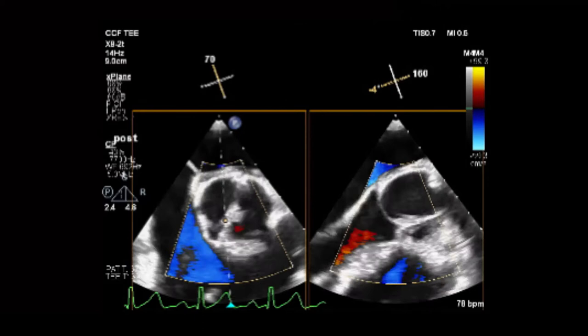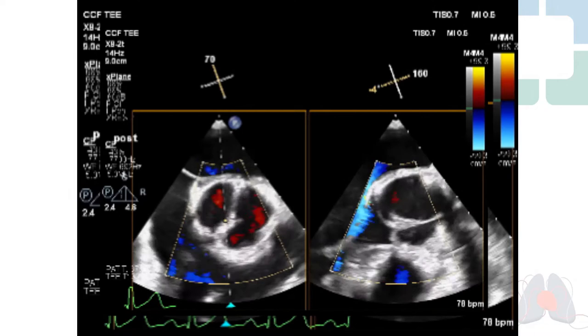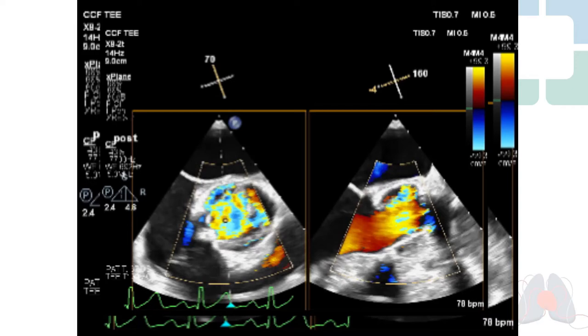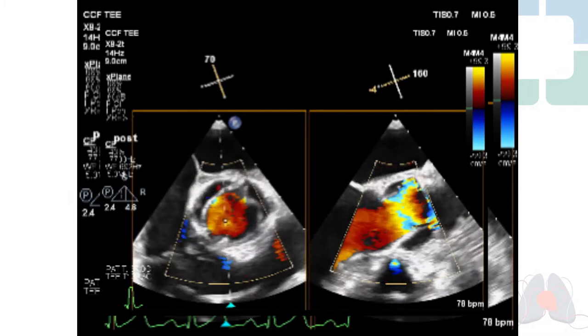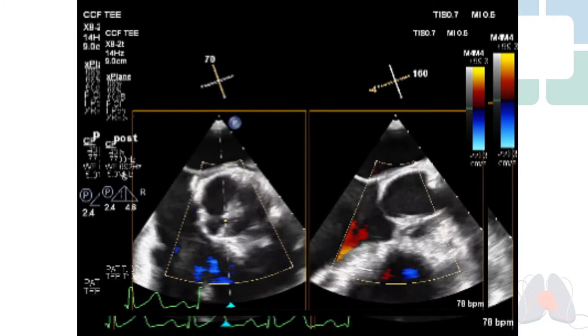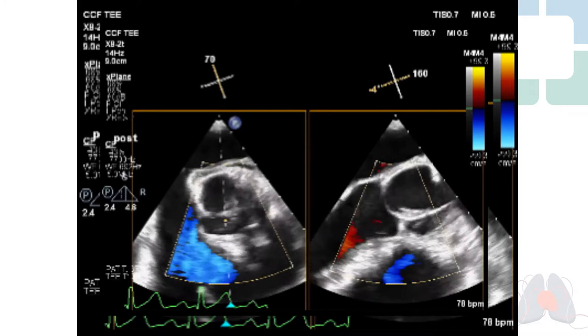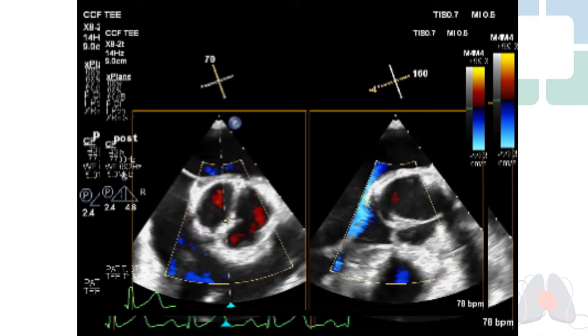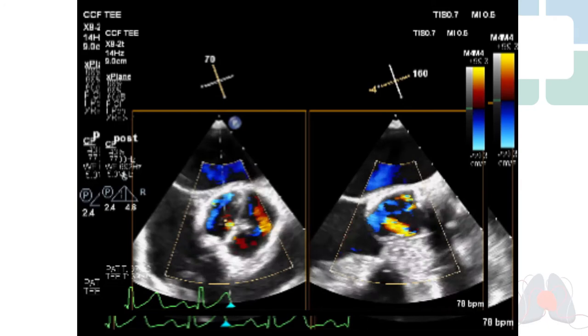Here's the post-procedure echo with no leakage from the valve, a nice approximation of the leaflets, and a good opening. The gradients were very low. Hopefully this is going to hold up well long-term. We have about a 2% to 3% failure rate in the first one and a half years after repairs, and the gradients also go down with time. The lowest gradient typically after a repair is about 18 months post-repair based on our own research. So if you have a slight gradient, don't be too concerned.